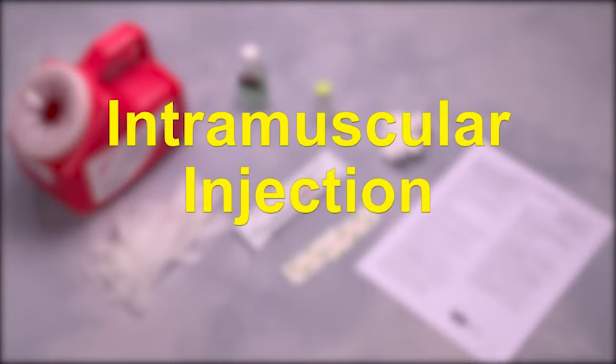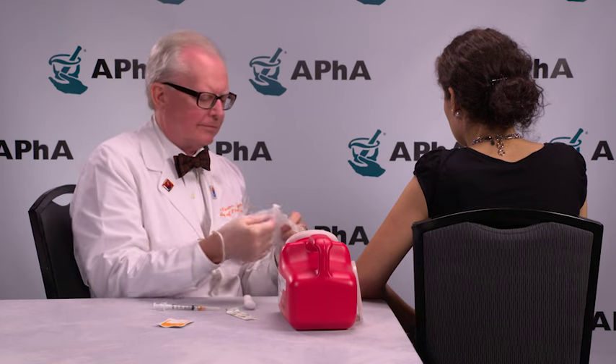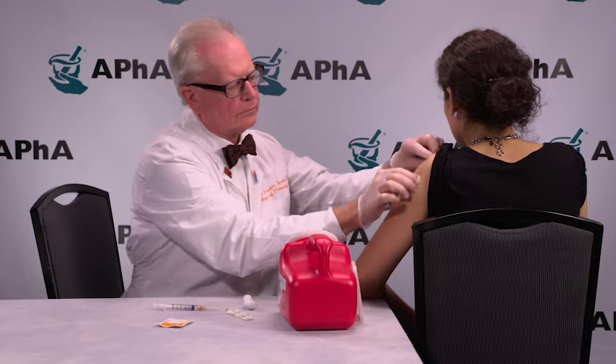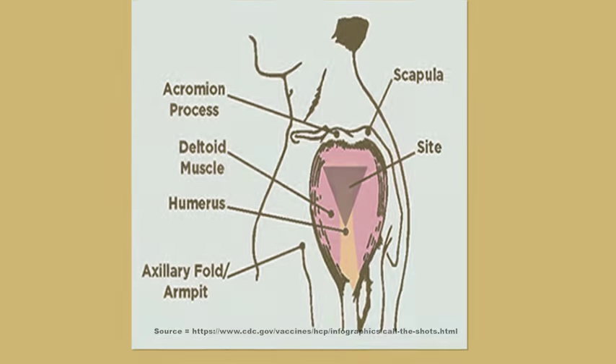The following is a demonstration of an intramuscular injection. Once you are ready to inject the vaccine, proceed as follows. Although gloves are not required, it may be prudent to use gloves for your protection and patient perceptions. Follow your local standards. Be sure both you and your patient are sitting. Expose the injection site, which is the thickest and central portion of the deltoid muscle. The midpoint of the deltoid is about 2 inches, or 2 to 3 fingers breadth, below the acromion process and above the armpit in the middle of the upper arm.